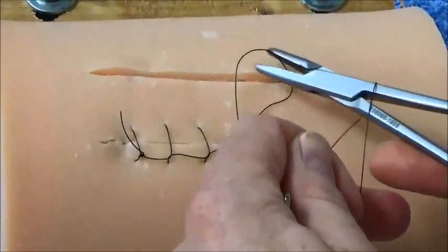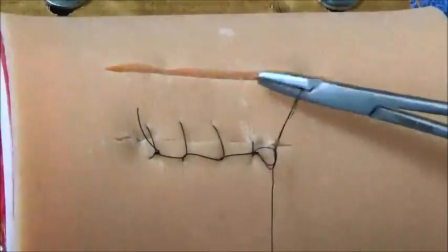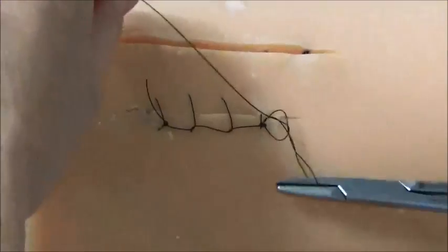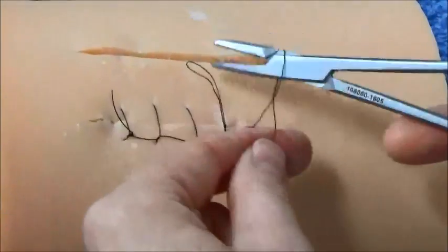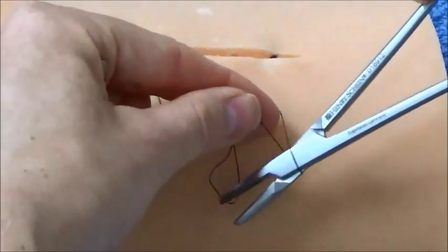So now I'm going to tie on 3 additional throws, again trying to keep the knot just off of center. Actually, I think because this is a loop and I'm in the skin layer, which I'd really like to have stay together, I think I'm going to choose to do 6 throws. Being careful each time to open the needle drivers and get nice square throws rather than half hitches.